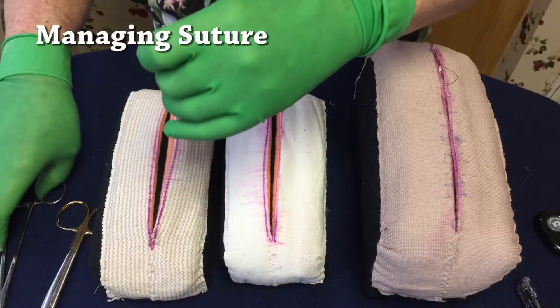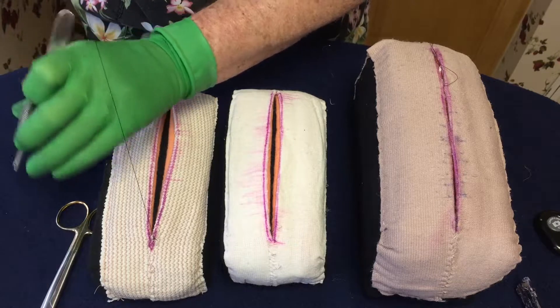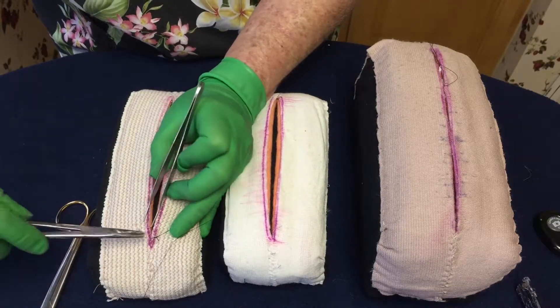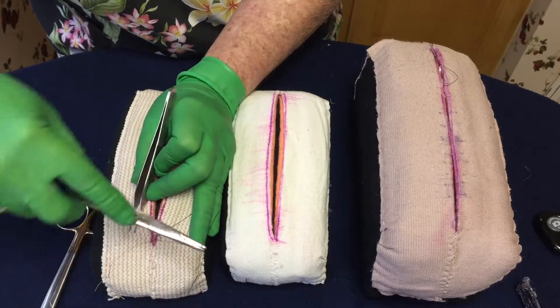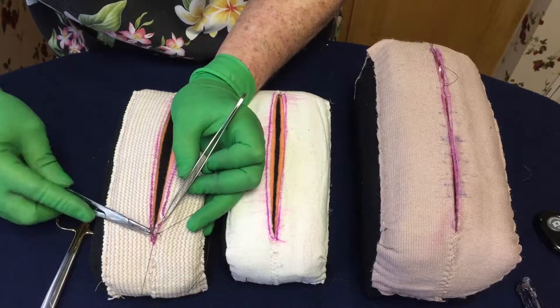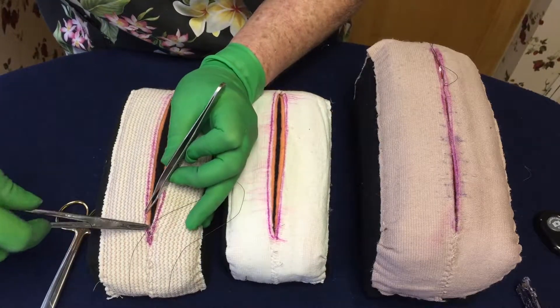If you're running a stitch, how do you manage the excess suture? One of the ways — and it's now a way of life with me — is managing it using my left hand, which I want holding the forceps, to go around the suture, hold it out of the way, and then my fourth and fifth fingers are holding it out of the way while I'm running it. You can see it helps control it, pulling it down, then getting my hand around it again so it's out of my way so I can suture.